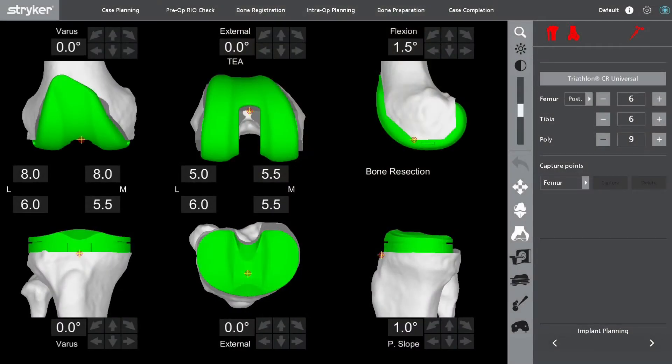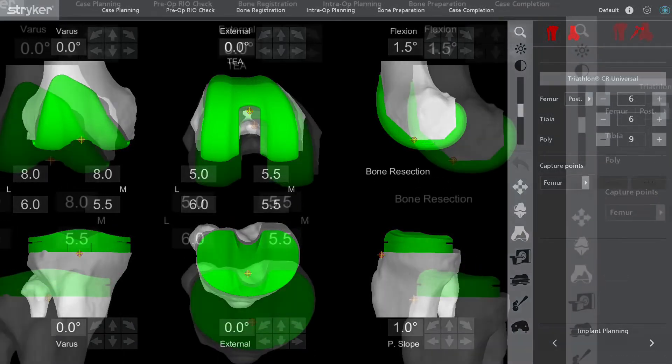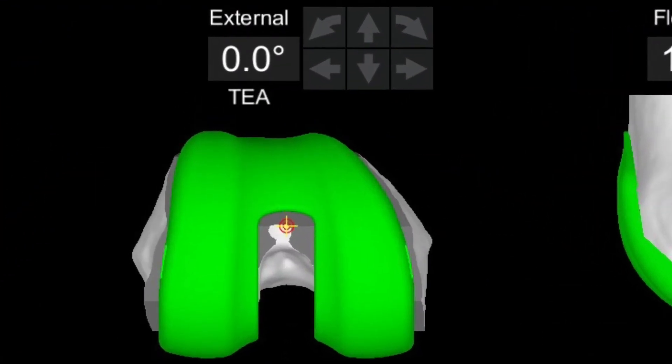Here's a screenshot of the actual computer screen I use in the operating room to help me do my planning. The green represents the implants. Along the top row, those three views are the front, the end-on, and the profile view of the femur. The same thing is along the bottom row — front, end-on, and profile view of the tibia. You can see arrows around every single one of these cross-sections — that's how I can adjust the implants before I ever make a cut.